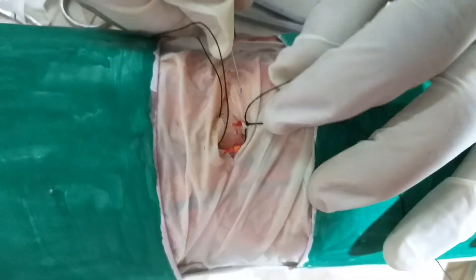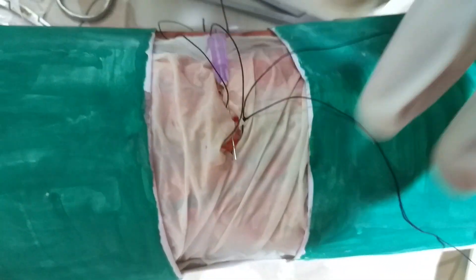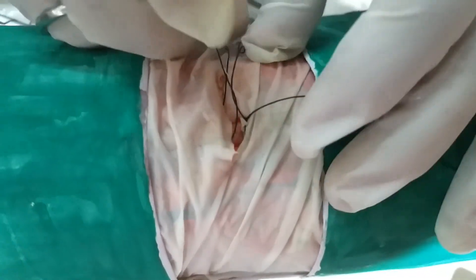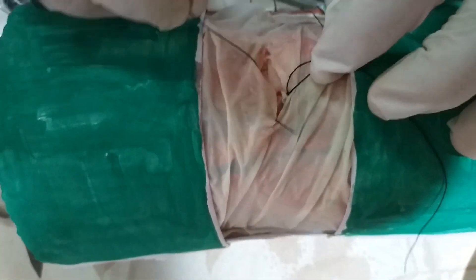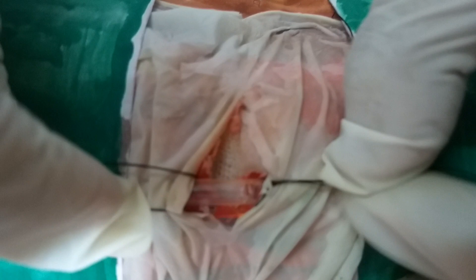Now you take a needle and pass it at the middle of the circumference of your vein. The needle has passed through the mid circumference of the vein. Now take your scalpel blade and give a nick over this needle. Once the nick is given, the vein will be punctured. You can see the hole — the vein is punctured.